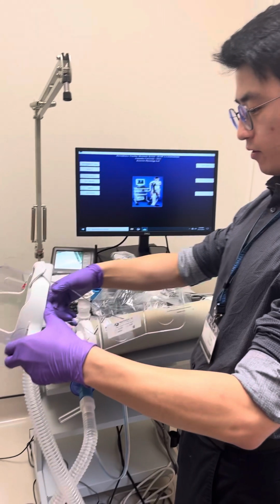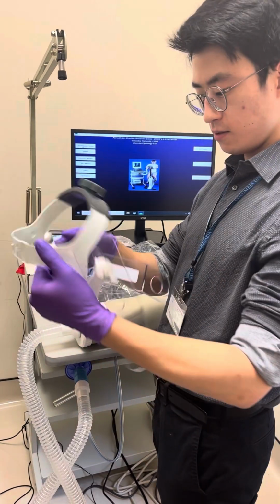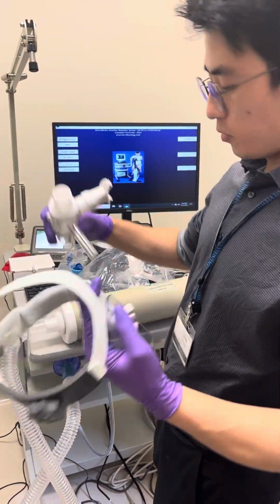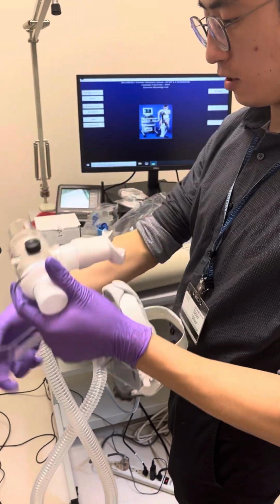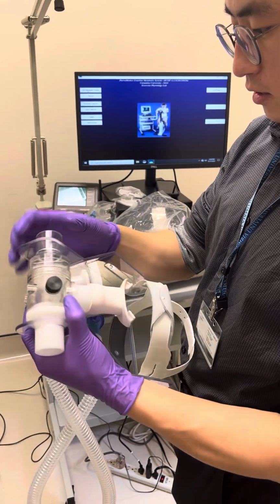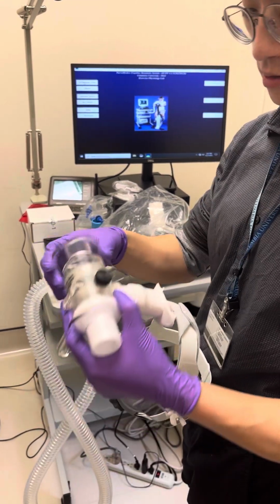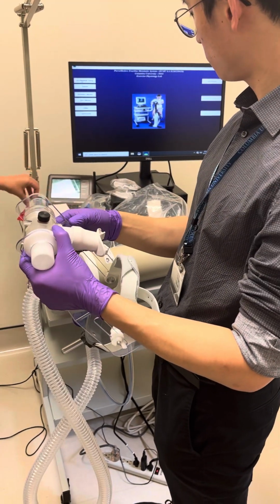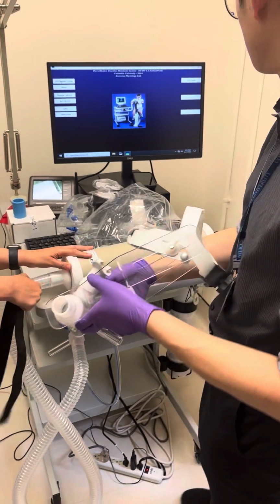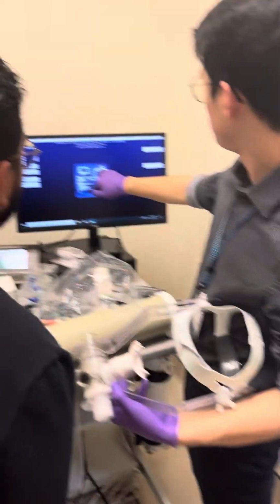All right, so this is the very unruly headgear. The way it works is one end goes in here and the other end goes in here, and this is the end that connects to the hose, right? I think it's the clear one. Okay. Well, I guess we're going to use the wrong one.